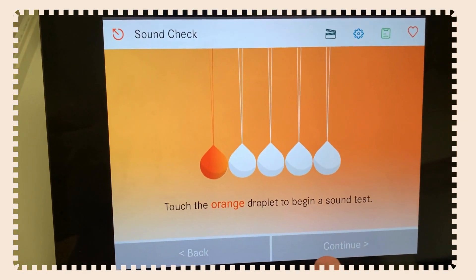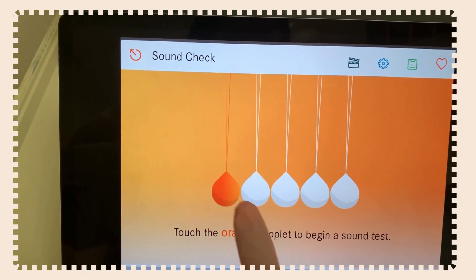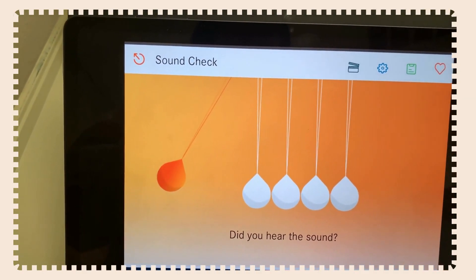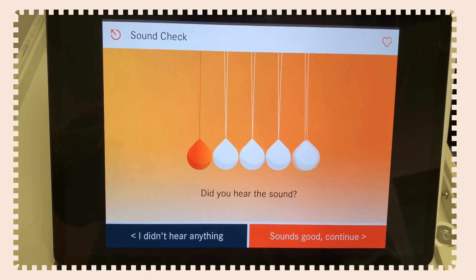Now let's test the sound. If you do hear a sound, hit yes and continue. If you didn't hear anything, click 'I didn't hear anything.'